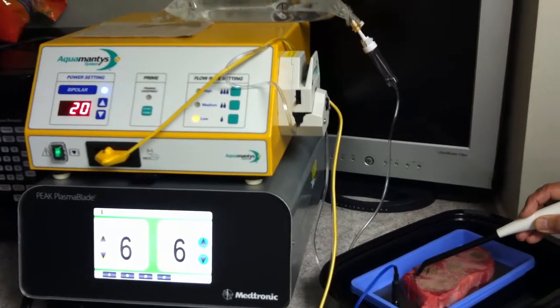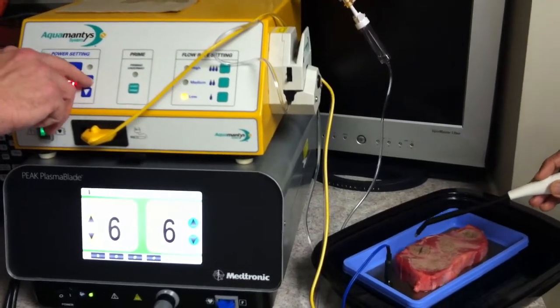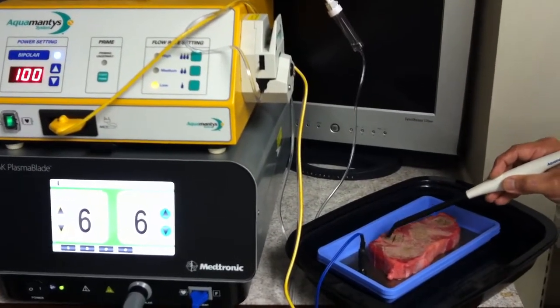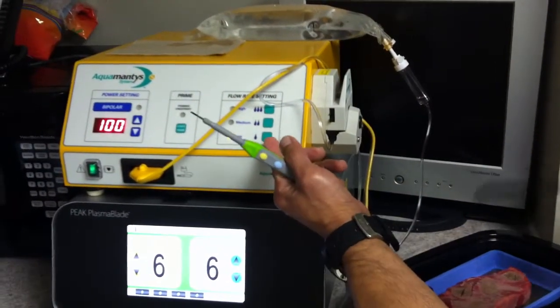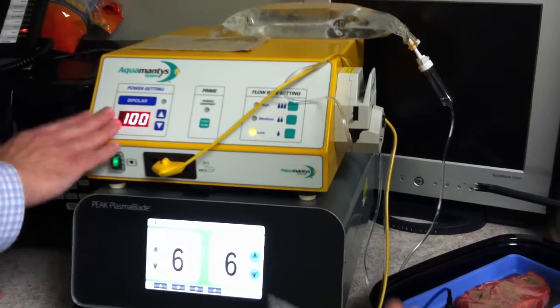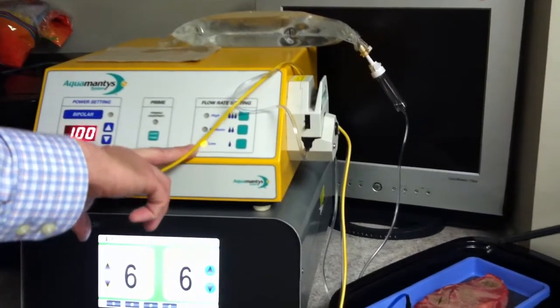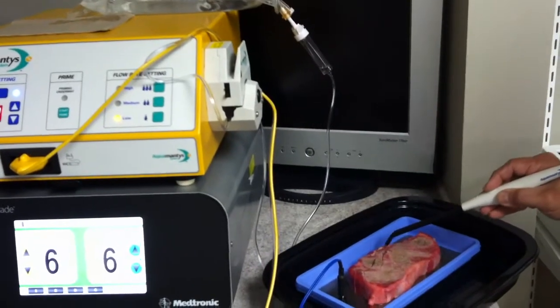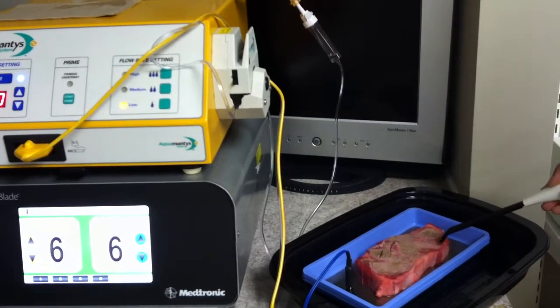So if you sit on it at 20, it just takes longer. If you go up to 100 at low flow, it's going to push more flow through because it's maintaining that balance. Okay, so this tells you how much fluid is coming out to the tip, not necessarily the temperature, because it's always going to be at 100. Power setting and watts. Yeah, so these two work together to maintain that 100 degrees Celsius. Okay. Awesome. I kind of like that 170 setting to start, but if you feel it's a little too aggressive, we can always back down to 150.